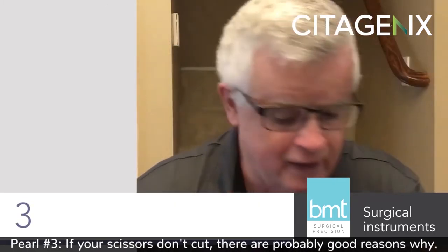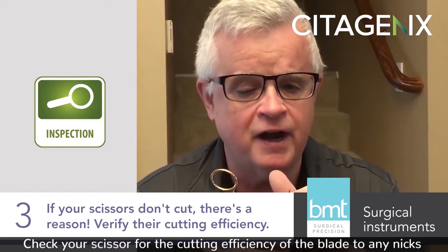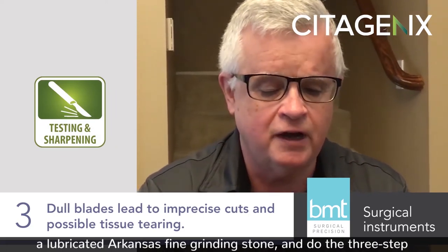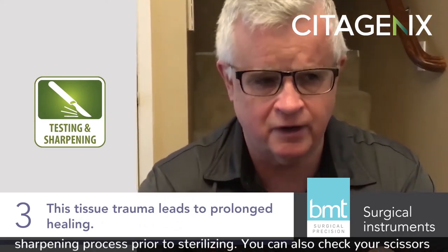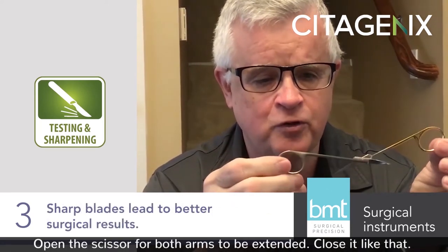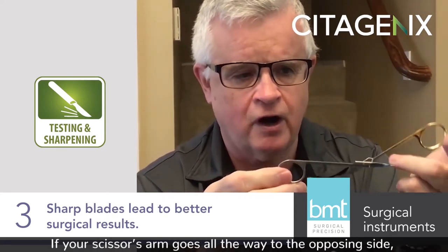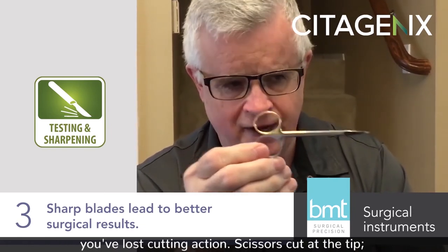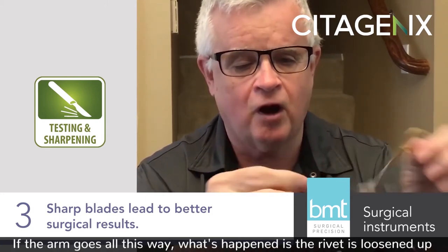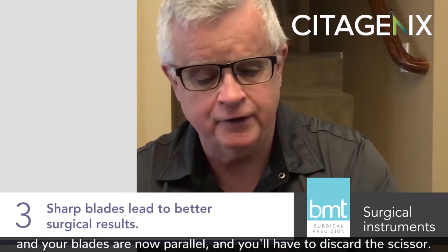Pearl number three: if your scissors don't cut, there are probably good reasons why. Check your scissor for the cutting efficiency of the blade and any nicks and gouges. Take an Arkansas fine grinding stone, lubricate it, and do the three-step sharpening process prior to sterilizing. You can also check your scissors on a regular basis with this simple test: open the scissor until both arms are extended, then close it. If the scissor arms stop before crossing, you still have cutting action. If the scissor arm goes all the way to the opposing side, you've lost cutting action. Scissors cut at the tip — 90% of their cutting action is there and the tips cross. If the arm crosses all the way, the rivet has loosened up and your blades are now parallel, and you'll have to discard the scissor.